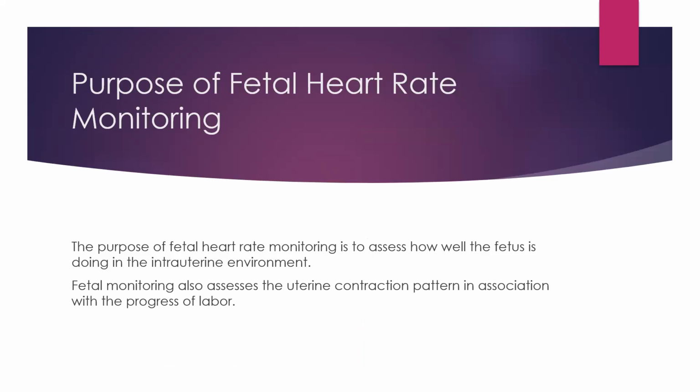Fetal monitoring can also assess the uterine contraction pattern in association with the progress of labor. So this gives us a lot of information on how often the mom is contracting, if that is a pattern that we are looking for, and if that's a pattern that we are associating with an active labor pattern and expecting the mom to be making progress in her labor.